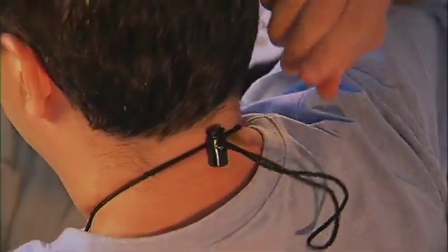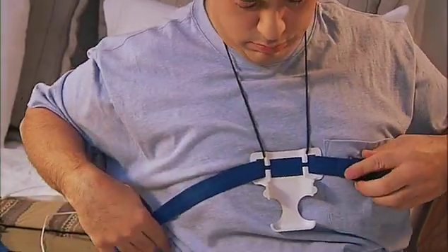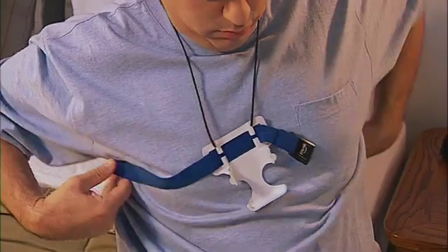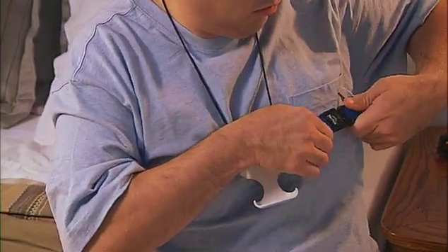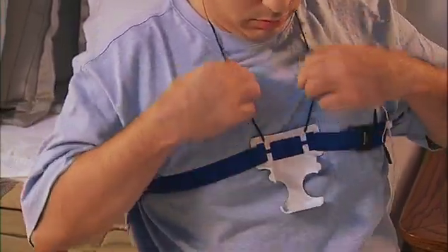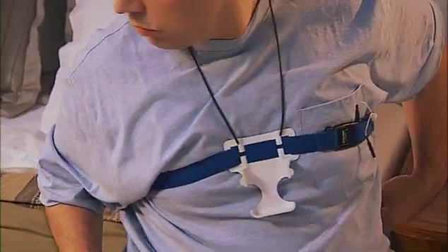Squeeze the two ends in the back of the lanyard to adjust the length. Adjust the chest belt so that the holder is placed in the upper chest area. With the holder in position, bring the rest of the chest belt to the front and snap the two belt ends together.